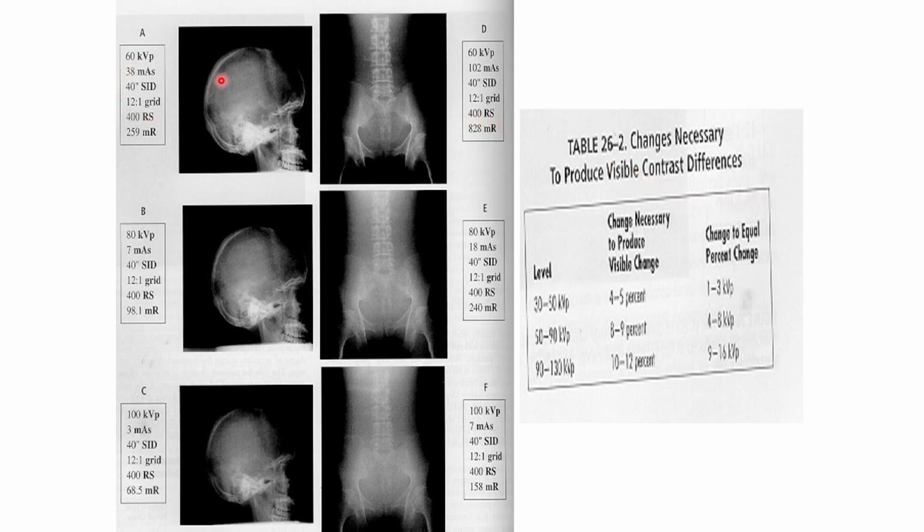So, dito naman letter A. Ayun, kita yung sa may frontal bone. Okay. Sir, bakit po itim yan? Okay, may frontal sinuses po tayo.